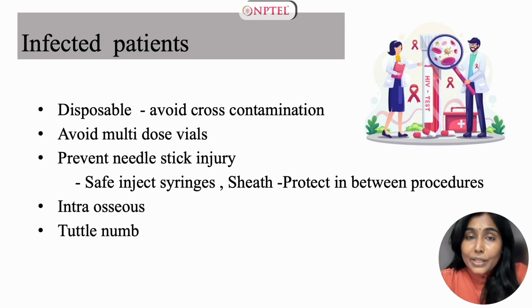The other category of patients which need to be handled carefully are the patients who have pre existing infections such as HIV, hepatitis, etc. So, when you handle these patients, you need to exercise extreme caution in avoiding cross contamination. So, please use disposable syringes, disposable needles. Absolutely no compromise on that. And it is good practice to avoid multi-dose vials. Use cartridges. We do not want to make any mistake at all.